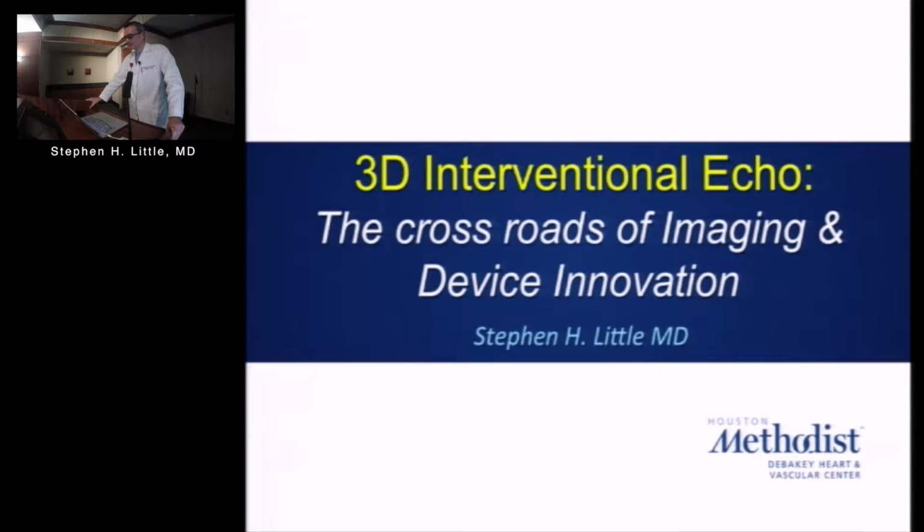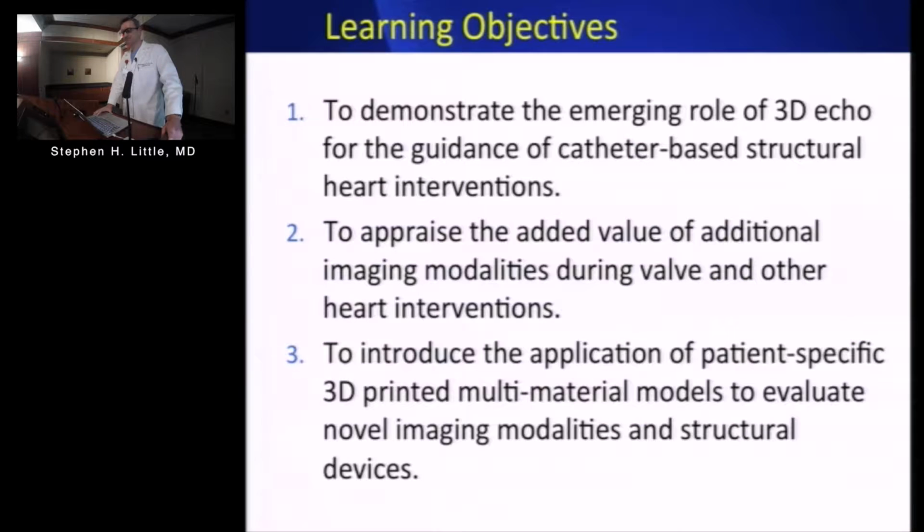So we tend not to do that here, but the way we do it is not the way everybody does it. And particularly for those who are in training, I think it's worth it for the fellows and for the sonographers to go through some of the image optimization that we do in our cases. So we'll talk about interventional echo really as a tool to talk about 3D specifically.